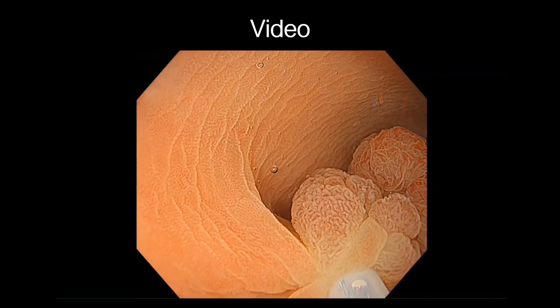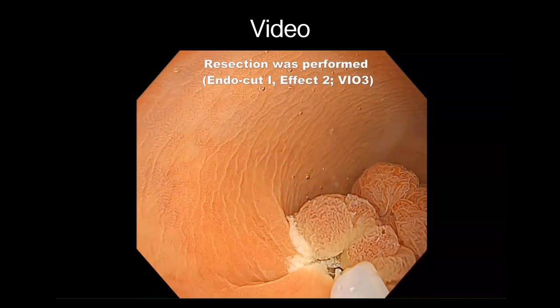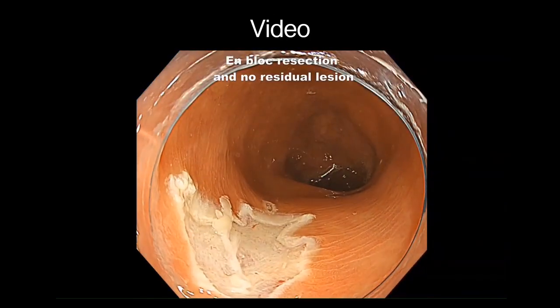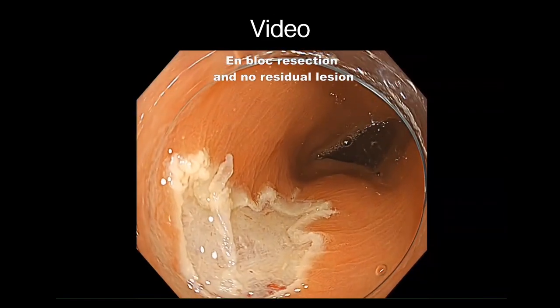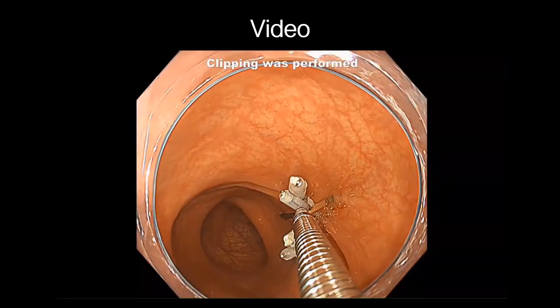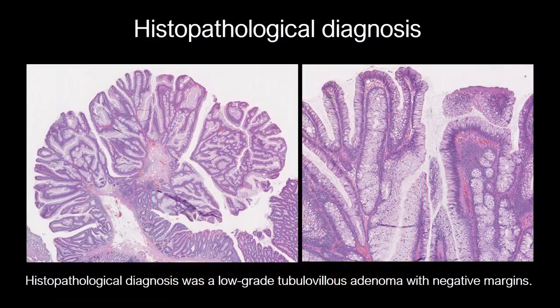After the lesion was captured, resection was performed using electrocautery. Complete en-bloc resection was achieved with no adverse event. There was no residual lesion after resection. The mucosal defect was completely closed using clips. Histopathological diagnosis was a low-grade tubular adenoma with negative margins.